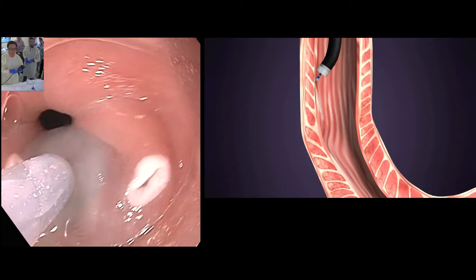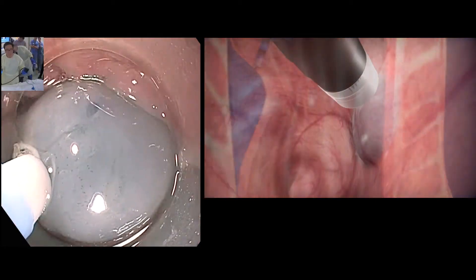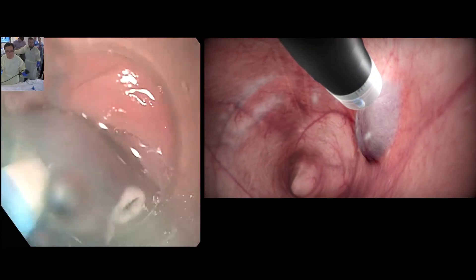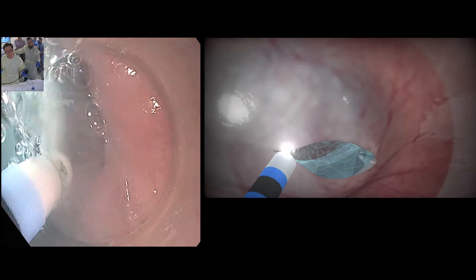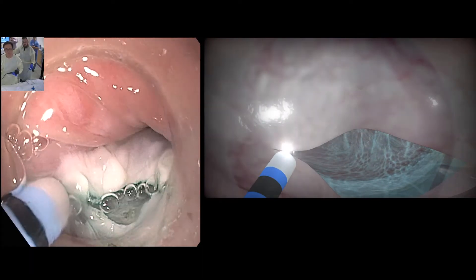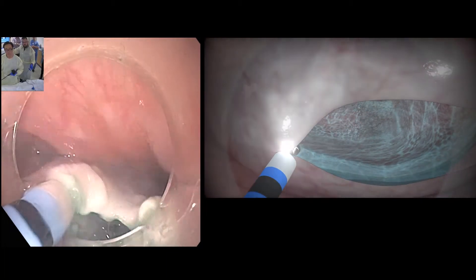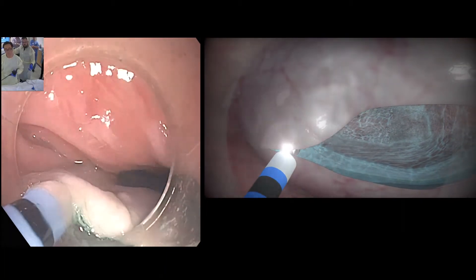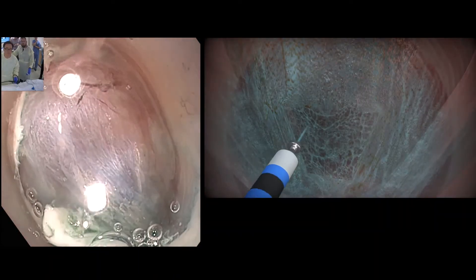Here at the start of the procedure, I am simply making an incision to get into that submucosal space to create this tunnel which separates the mucosa from the deep muscle. Here's the incision, and I'm using a very precise knife that allows me to both cut, and I can inject fluid forcefully to open the space up. The submucosal tunnel is carefully performed.